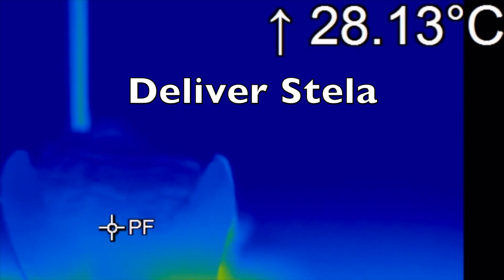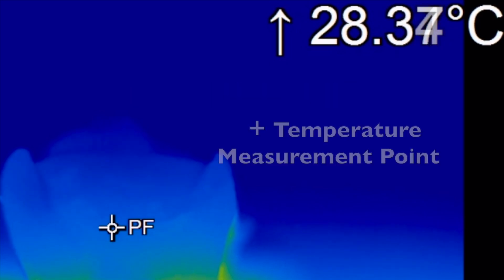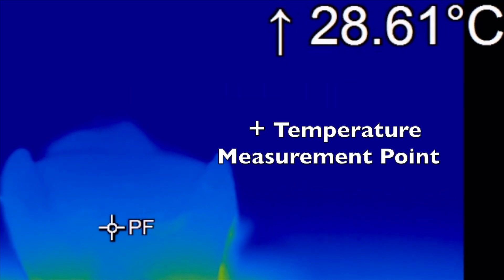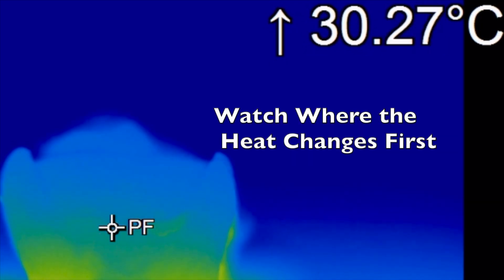Please note this video has either been sped up or slowed down to make viewing easier. The crosshair where it says PF indicates where the temperature has been measured in real time. Now watch where the temperature changes. The video has been sped up and slowed down to highlight certain points.